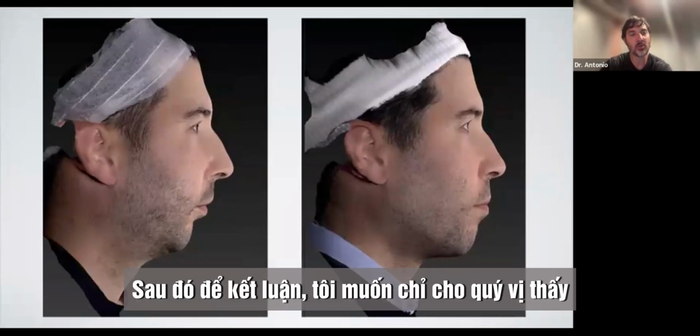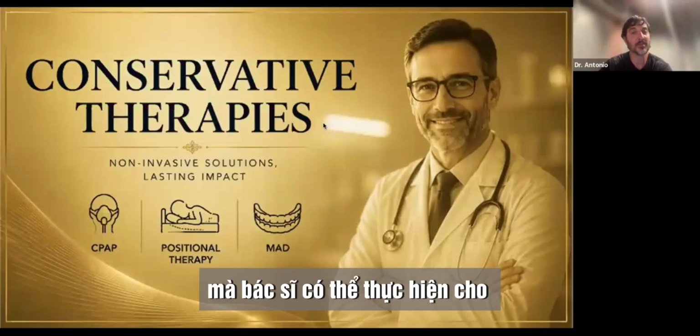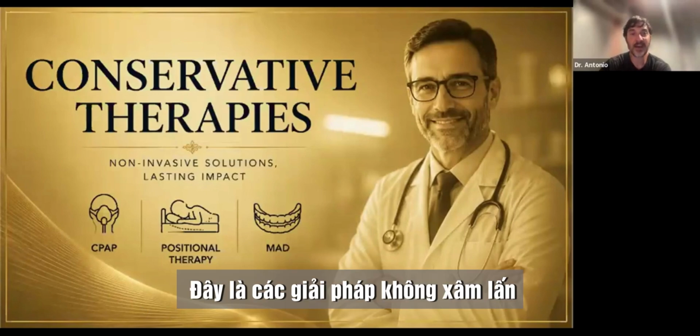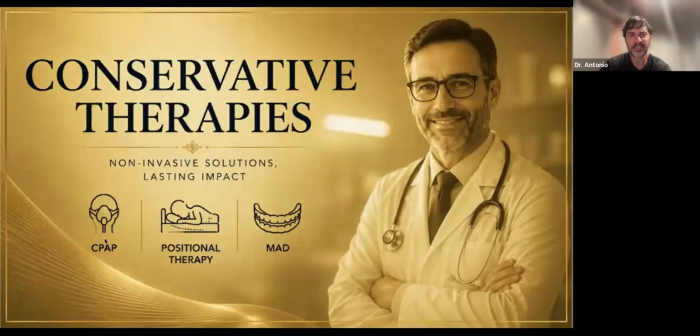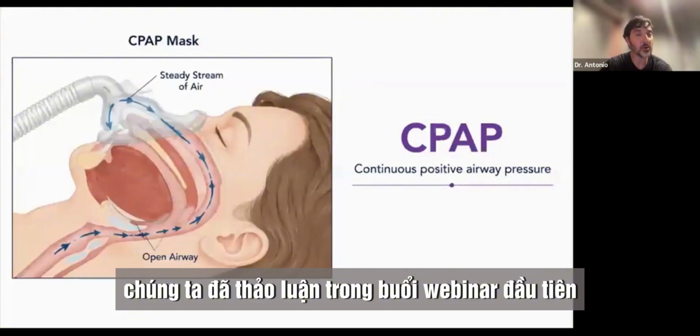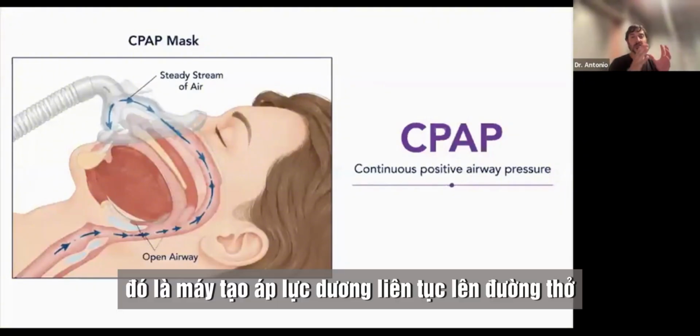Then to conclude, I want to show you the so-called conservative therapies that can be used by the physician for snorers and those with apnea. These are non-invasive solutions: CPAP treatment, positional treatment, and MAD treatment. The CPAP treatment we already talked about in the first webinar, but it is the so-called continuous positive airway pressure machine.